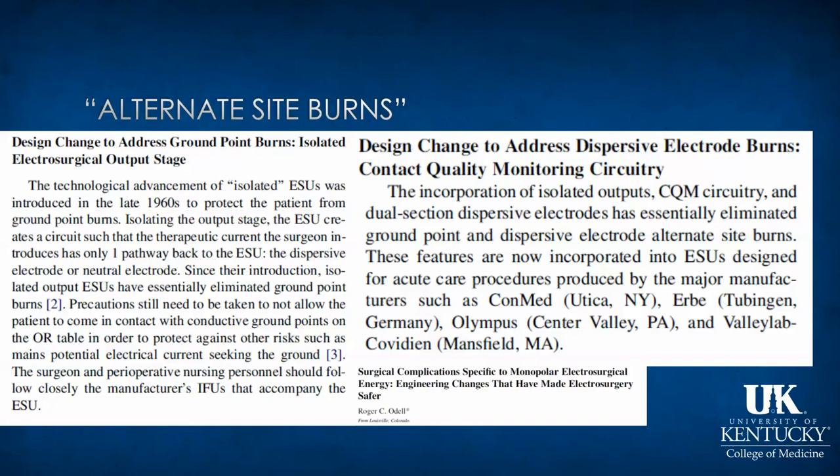And one of the things that I've learned in reading and preparing this podcast is that the injury to the patient at the dispersive electrode is not always immediate or immediately noticeable, and these burns are picked up later.